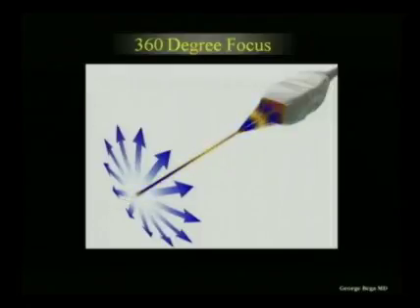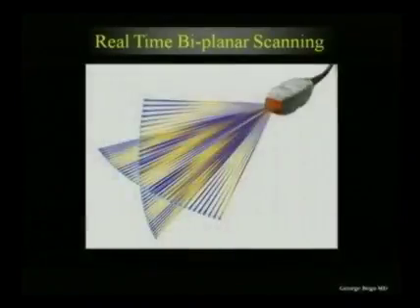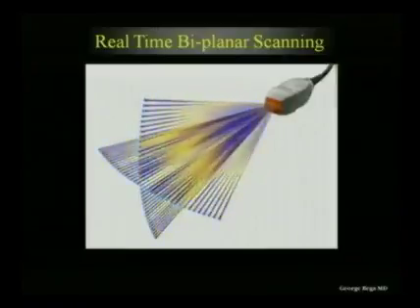This is truly something that we will use increasingly in improving our understanding of abnormal and normal anatomy. Definitely this is the real improvement over the current acquisition methods that are not able to focus in any direction.